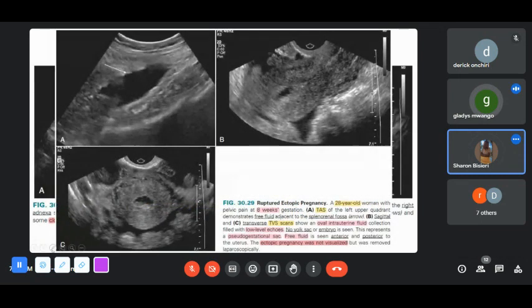So I hope, Doc, you'll be getting your colleagues to report on the images. Do you want to discuss all of them? I didn't have a quiz section. Maybe for today you can just give them the history and then they can discuss, to make it much more interactive.